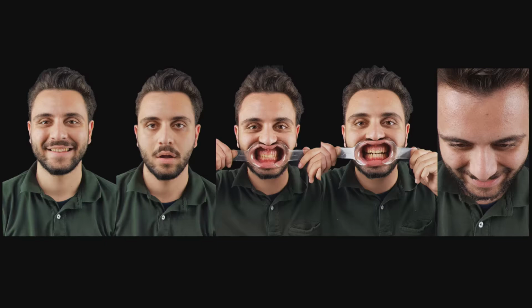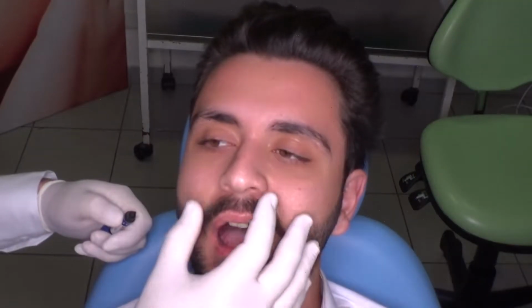And now is the time to put a single composite on the central incisor. It shouldn't be the best composite that you can do. It just should be a small piece to define the new incisal edge position, a new vestibulolingual position of the teeth. To have some reference points, open a little bit in rest.